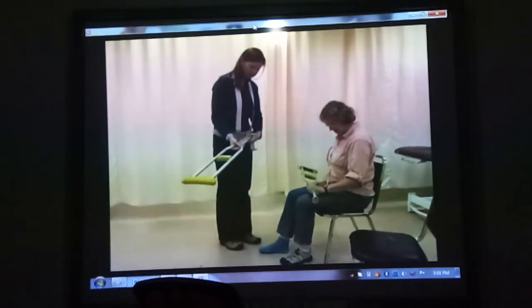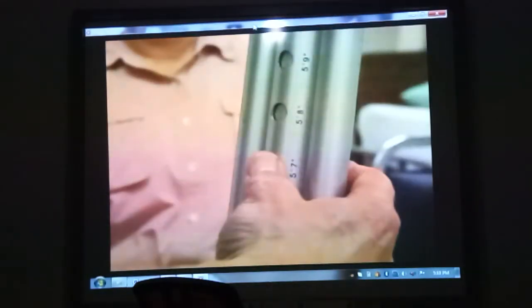Before gait training begins, you must first adjust the crutches to your patient's height. First adjust the height so it is level with the greater trochanter or even with the wrist crease with the upper extremity by the side. Secondly, observe the angle of the elbow. It should have flexion between 20 to 25 degrees.